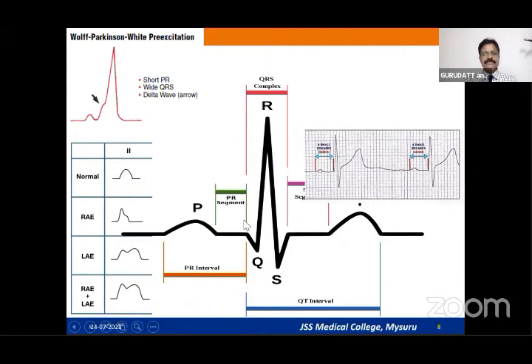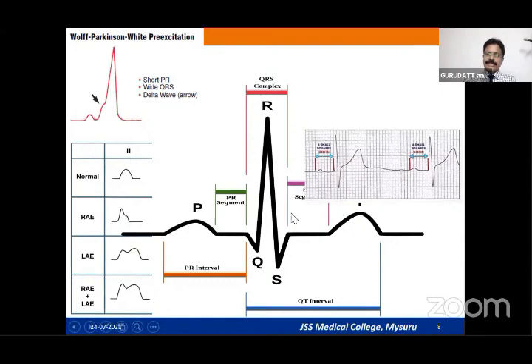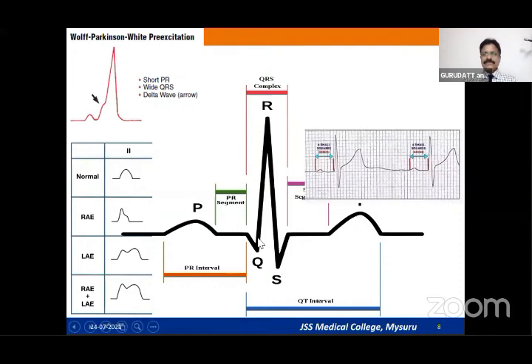Normally the Q wave is very small or absent. A pathological Q wave has a width more than 1 millimeter and a depth more than 25% of the succeeding R wave. If there are associated ST-T wave changes like ST elevation, it represents an acute transmural infarction. If there are no active ST-T wave changes and only a pathological Q wave, it represents an old infarction.